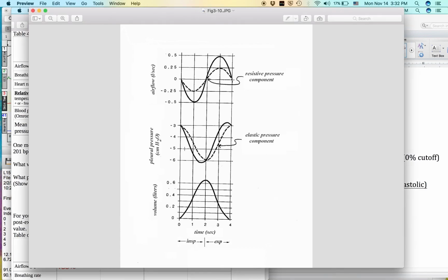So just to explain what I discussed earlier about what a breath is regarding an inhale and an exhale on your airflow, it's a little bit easier to see in the pulmonary lab where we had volume in liters increasing with an inhale and then decreasing with an exhale. But regarding our flow, our 0 is where the air is not moving anymore.